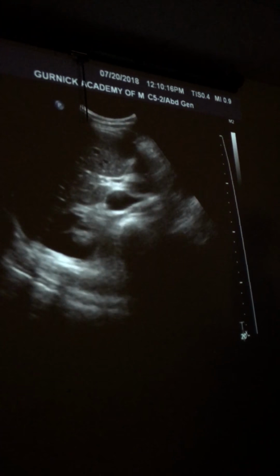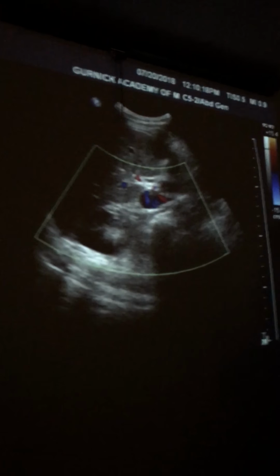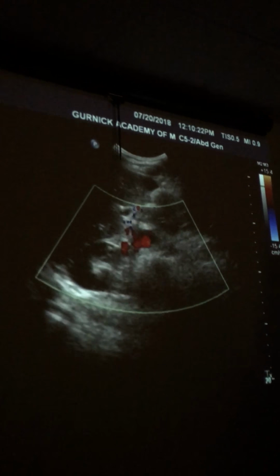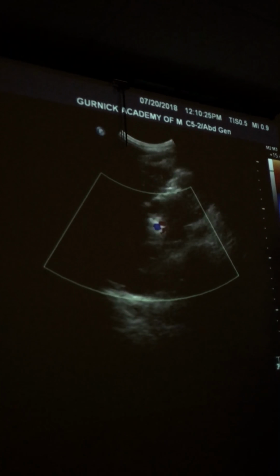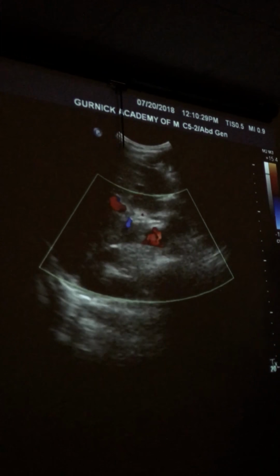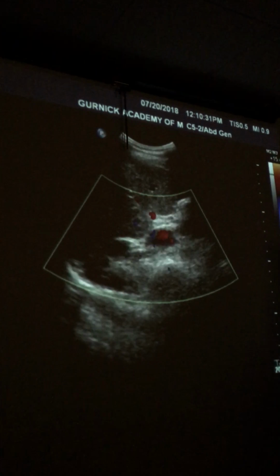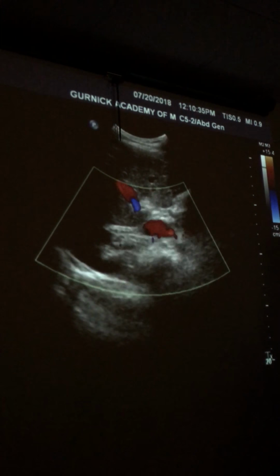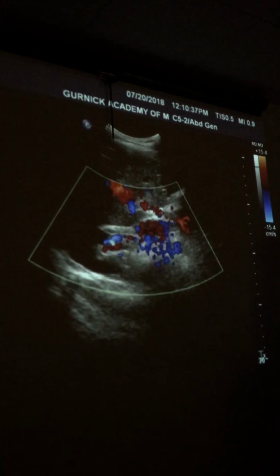See, there's her little kidney. For our competency, you want us to show it coming off the IVC, not coming out of the kidney. Correct? Little breath in. Bonus picture. So she wants the right renal vein coming off the IVC, going to the kidney.